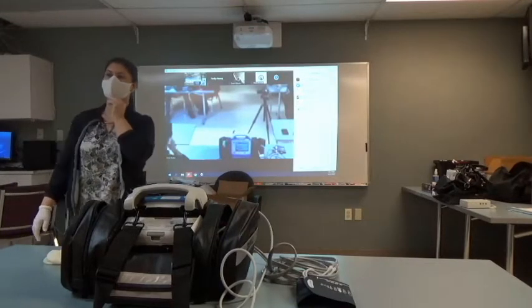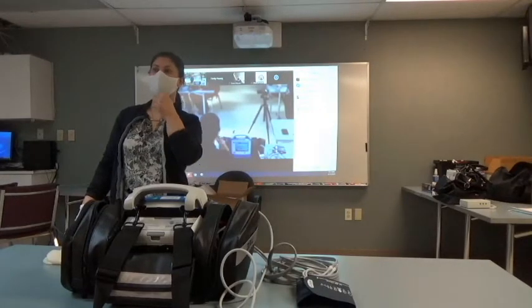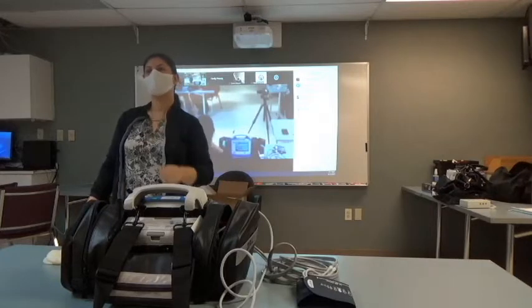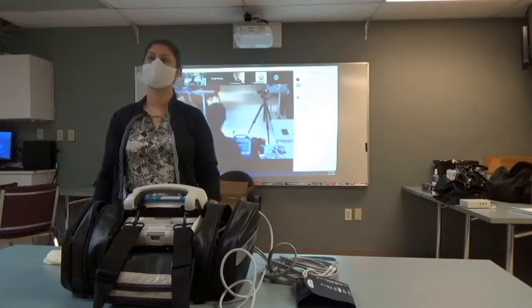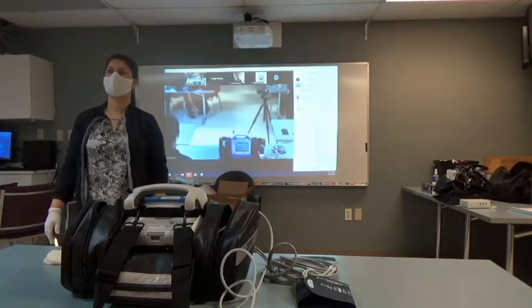Okay. Yes? So every time the monitor gets turned off, it goes back to manual? Correct, at this time. Yep. If they set it up to be auto, it'll just pop up on its own whether you use it or not. I'm trying to digest all this. So just to make sure I understood that correctly, we can't program these devices so that when we turn them on, it's going to automatically cycle every 5 minutes. Is that right?